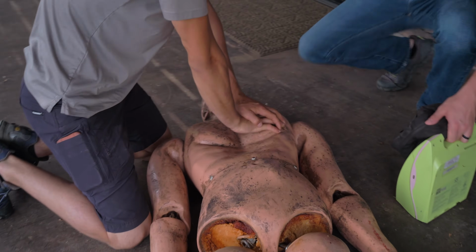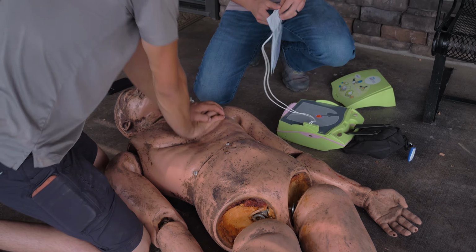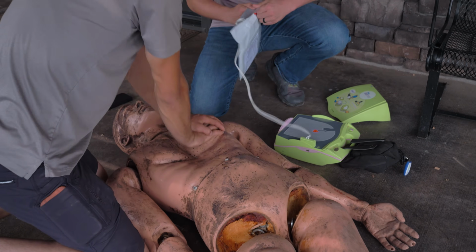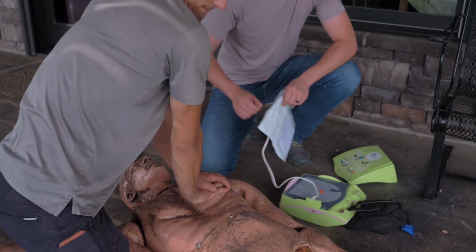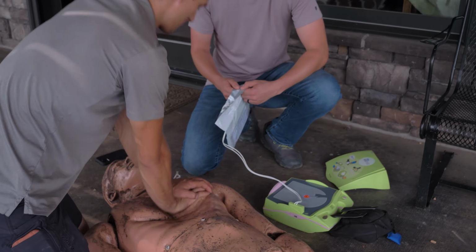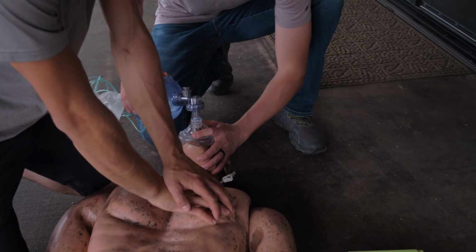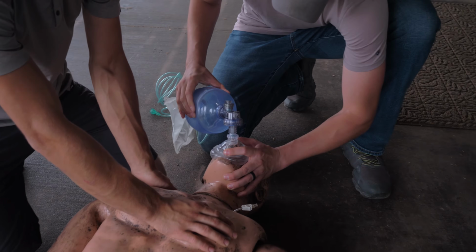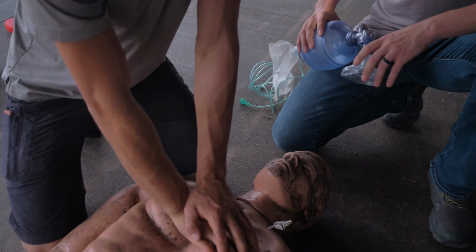Alright. Okay, ambulance is on its way. I'll get the AED put on him. Alright, start compressions.